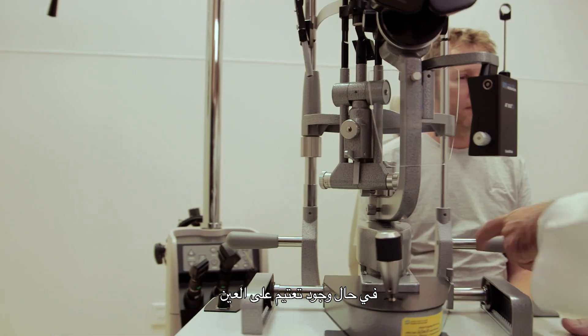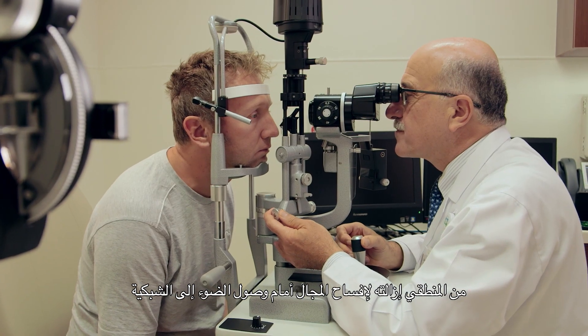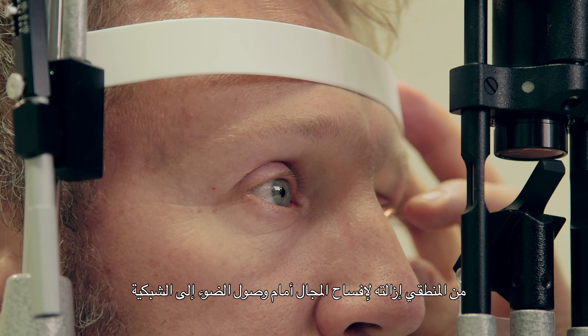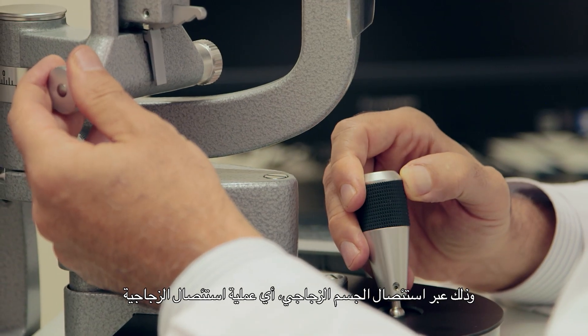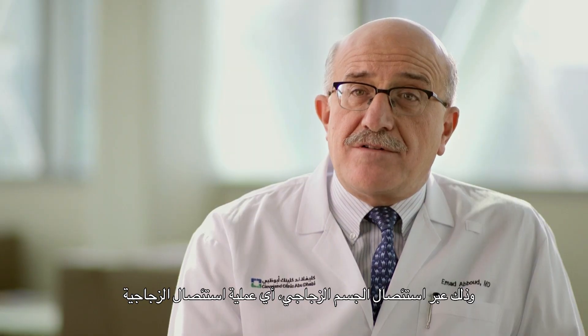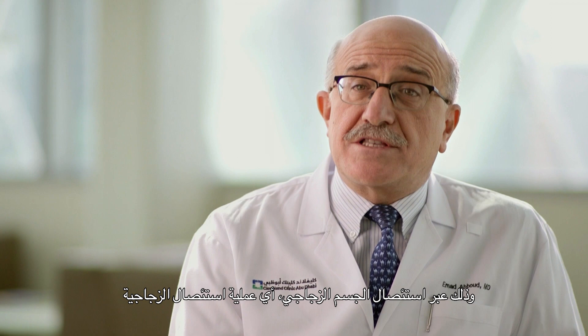Because there is an opacity inside the eye, the logical thing is to remove that opacity to clear the way for light to reach the retina. The way to do that is the removal of the vitreous jelly, and this is what we call vitrectomy.